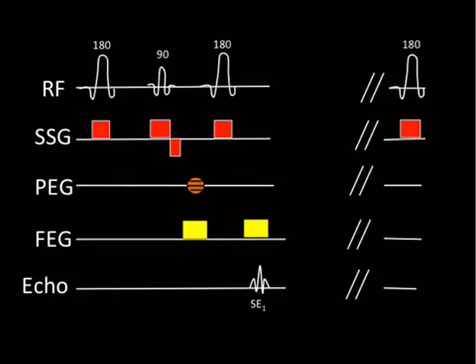All right, so moving on to this idea of inversion recovery. This is a little bit different. This time, notice that instead of starting with 90, I'm starting with 180. So you've got this additional 180 in front of the 90 and then 180. It's still sort of a spin echo in this particular case because you did a 90 then a 180, but it's this special kind of spin echo. This right here makes it different. This is what makes it an inversion recovery, and I'll explain that.